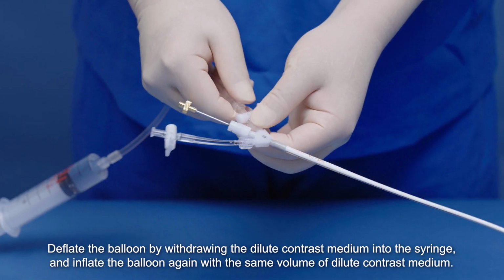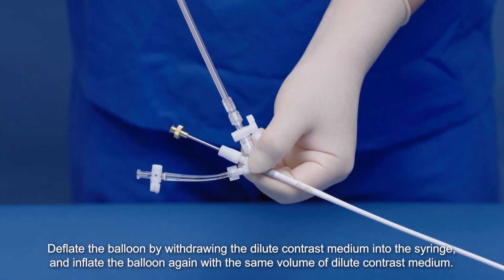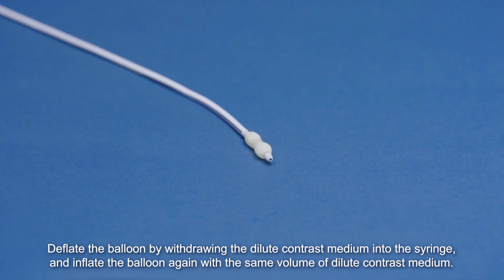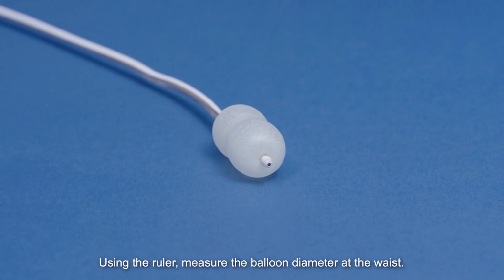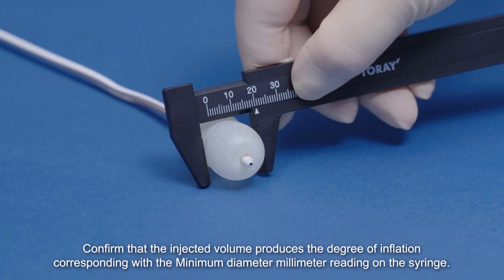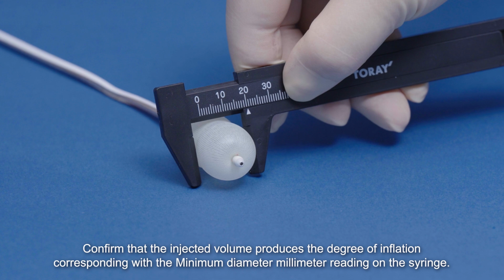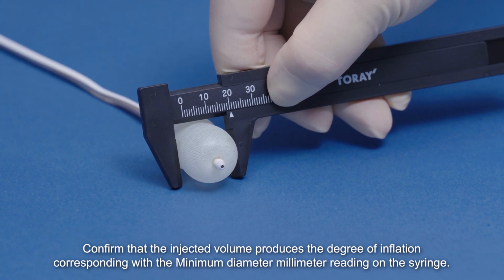Deflate the balloon by withdrawing the dilute contrast medium into the syringe, and inflate the balloon again with the same volume of dilute contrast medium. Using the ruler, measure the balloon diameter at the waist. Confirm that the injected volume produces the degree of inflation corresponding with the minimum diameter millimeter reading on the syringe.